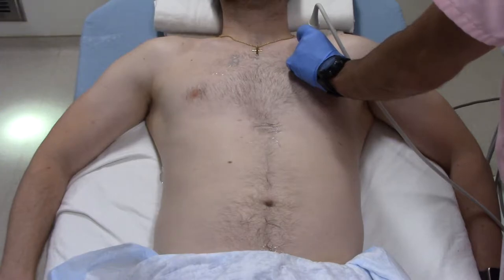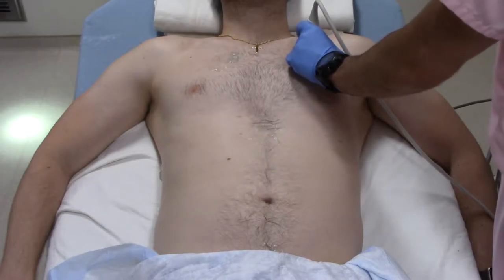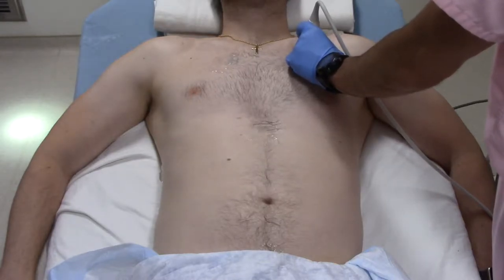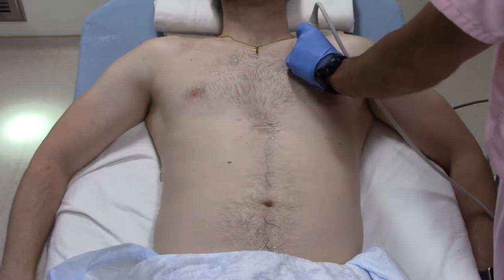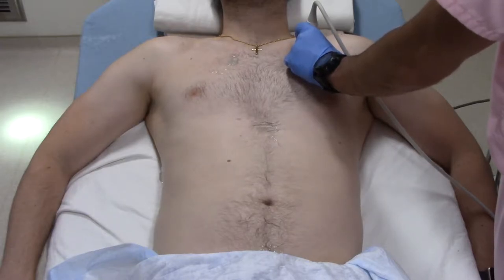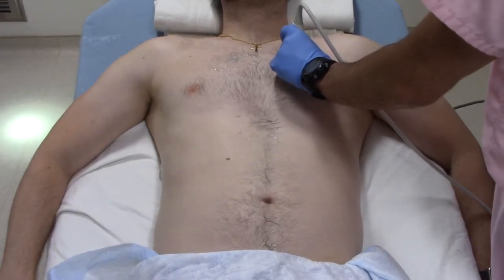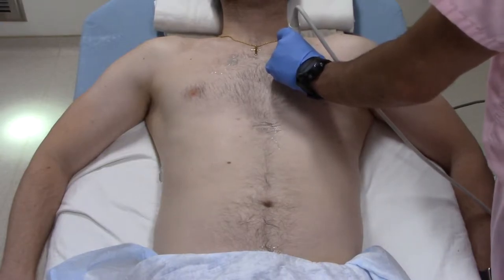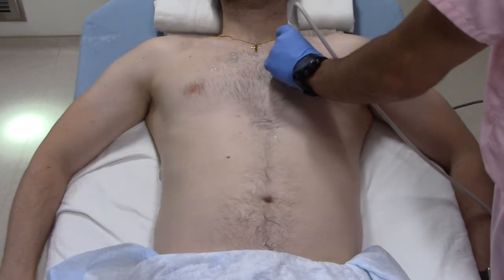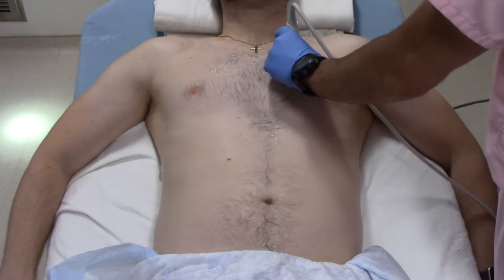Label left lung, hit acquire, making sure we see our rib. You can also use M-mode imaging. When you click M-mode, set your cursor where you find a nice bright white pleural line. Click M-mode again and wait for it. You can see that the pleural line moves and the image is very pixelated. Everything underneath the bright white pleural line should be pixelated if there's lung sliding. Compare to the other side if needed. Freeze and acquire to save your M-mode image.